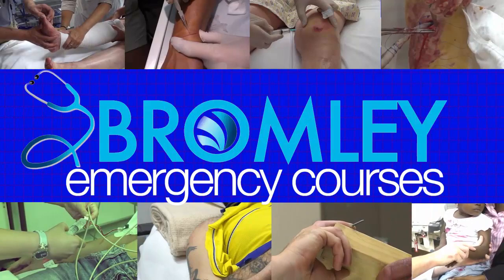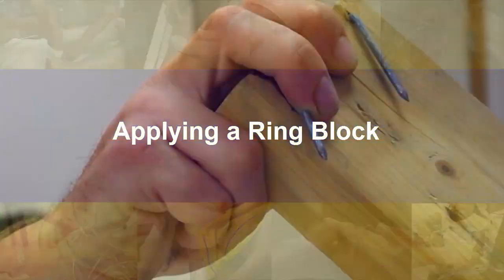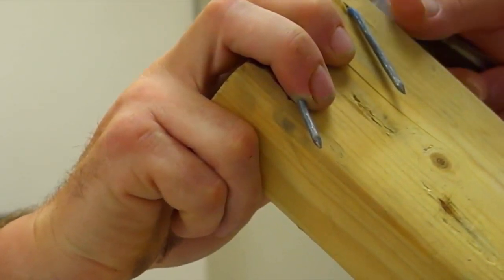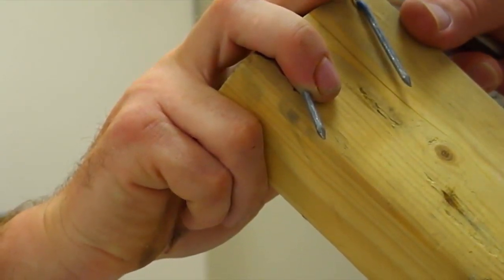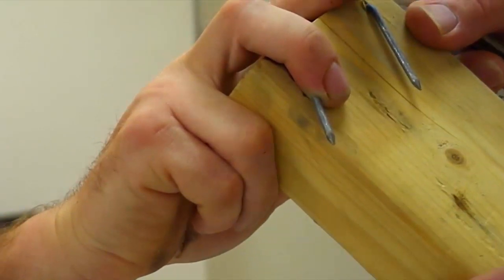This 40-year-old scaffolder has been throwing a piece of wood, and a nail in the piece of wood has gone through his right middle finger. We're going to put a ring block into the finger before removing the nail.